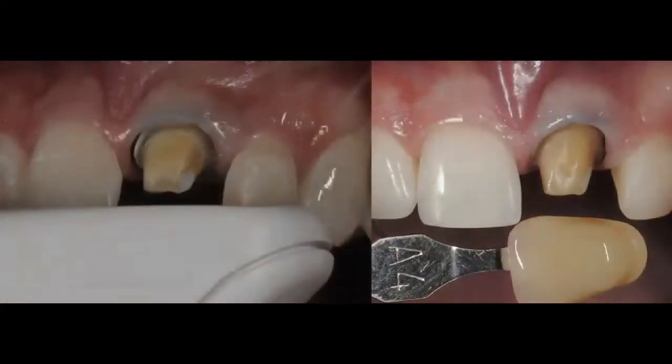Now, the first thing that I'm going to do here is, because this patient presented to my practice already with an existing restoration, and the tooth underneath that restoration was very, very dark. It had been endo treated for many, many years. It had a very, very dark substrate, very dark dentin. I didn't have any chance to bleach the tooth, because if I have a patient with a single dark tooth, and that single dark tooth does not have a restoration, my first option is always going to be to bleach that tooth and to try to get back an ideal shade, in order to make it easy for me. That way I don't have anything to mask.